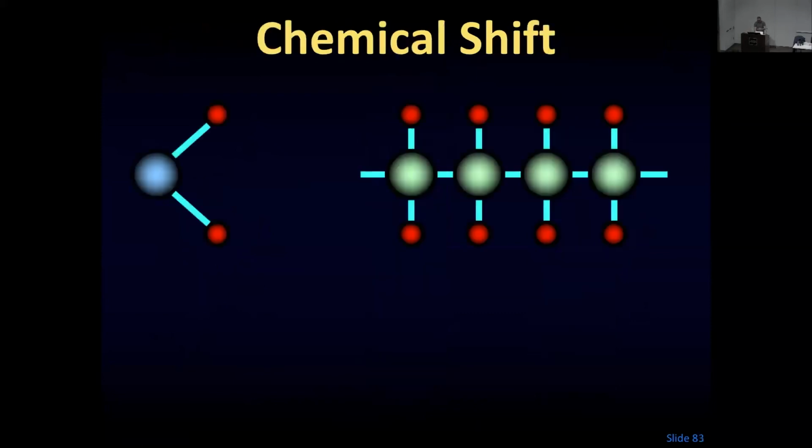Okay, so this now brings us to the last topic for this first lecture, which is chemical shift. I mentioned earlier that protons experience different magnetic fields in part because the protons themselves alter the magnetic field. Because it's spins altering the magnetic field of other spins, which I didn't make clear before, that can sometimes be called spin-spin relaxation. The protons, the magnetic dipole moments, alter the magnetic field of other spins, so that's known as spin-spin relaxation.